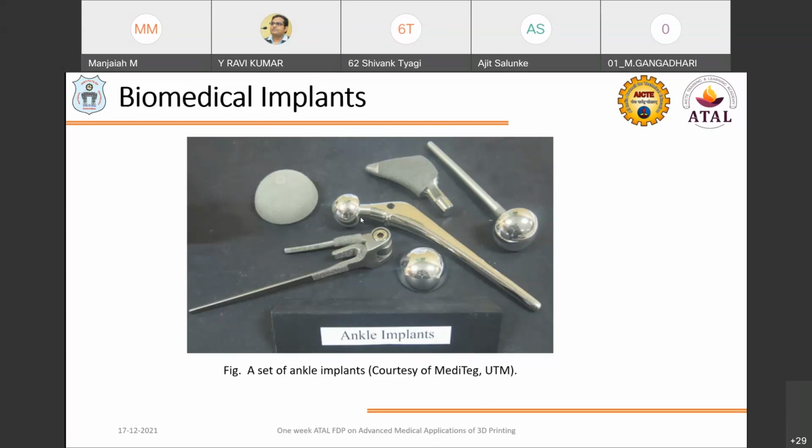That's why new methods and developments that biomimic the materials or properties of bones are needed, to address the complex issues of particular patients, and this can be done with the 3D printing process. Earlier, this was addressed by conventional casting and powder metallurgy methods. With those, we cannot address many of the difficulties when implanting, because implants and restoration parts are prone to failure because of stress shielding. That's why these things can be addressed by the 3D printing process.